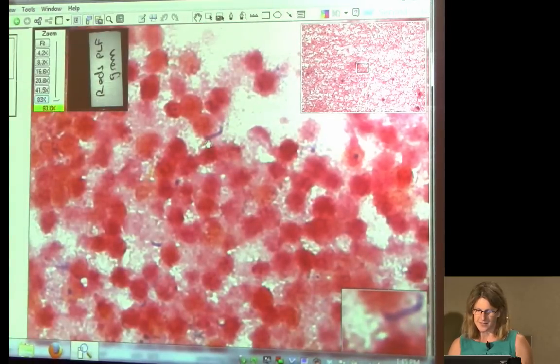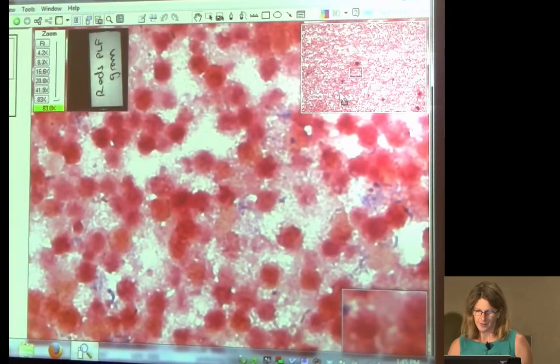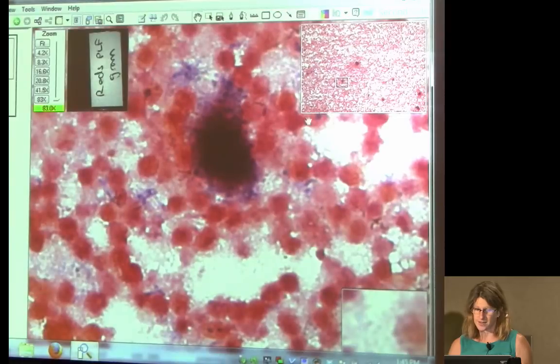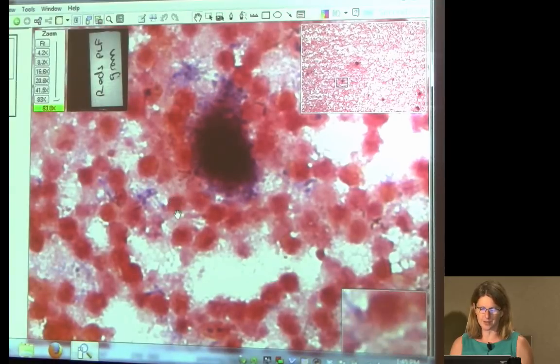see the nice filamentous gram-positive bacteria. And let me go on. And see, there was even more that I wasn't picking up. And see how they're forming these beaded filaments. It's really hard to get this in focus on oil, so it's never as good as a microscope, believe it or not, but it's pretty good.